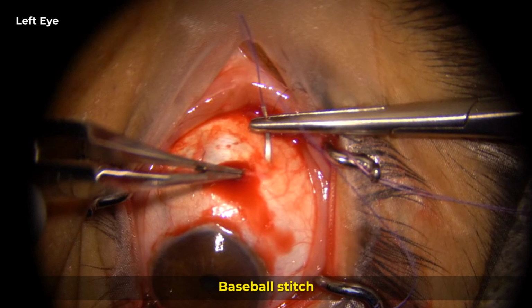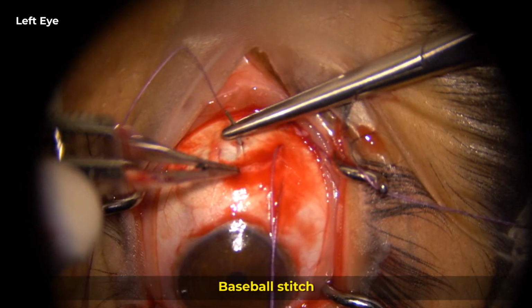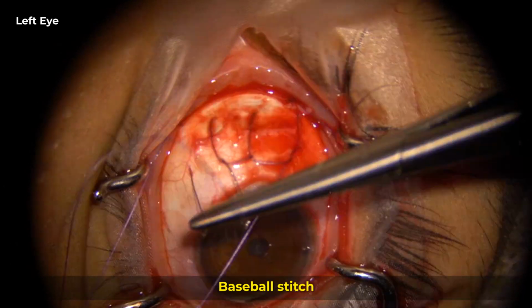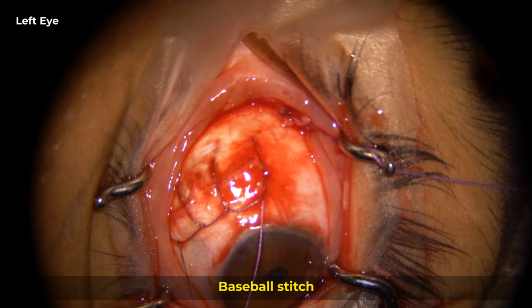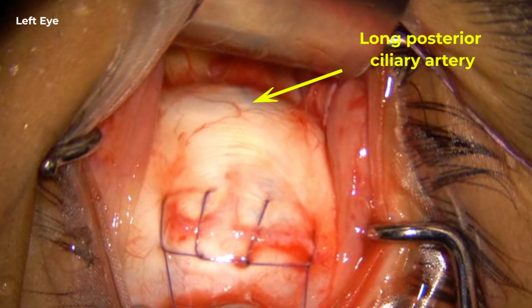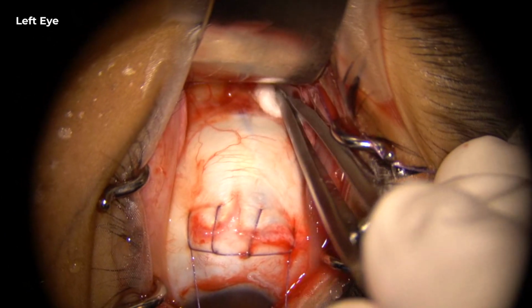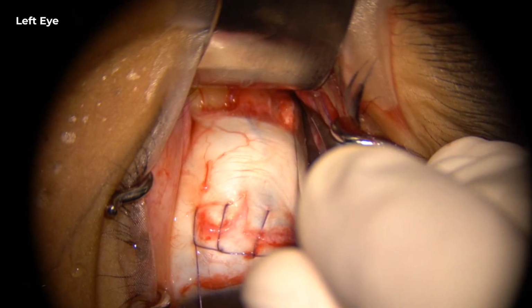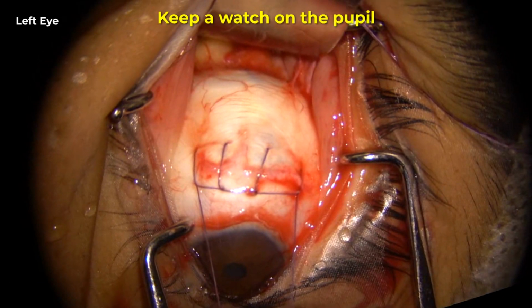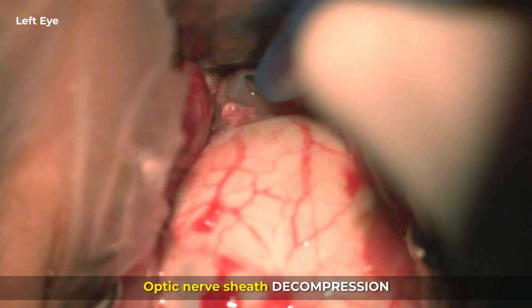Then a baseball stitch with a 6-0 suture and interlocking bites is taken across the medial rectus insertion. Remember, this is the most important step in this surgery. The globe is then retracted laterally to expose the intraconal space. Here, first follow the long posterior ciliary artery, which takes us right up to the optic nerve, and then the short posterior ciliary arteries to isolate the optic nerve. Intermittently, you have to observe the pupil, look for a blood-free area, and make an entry with the angle keratome.